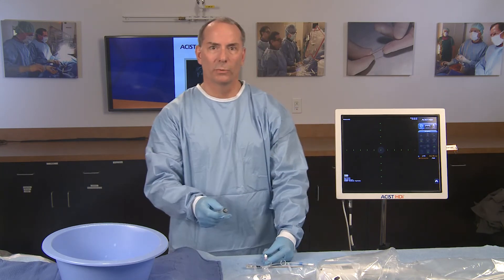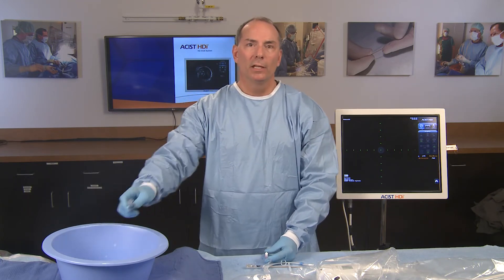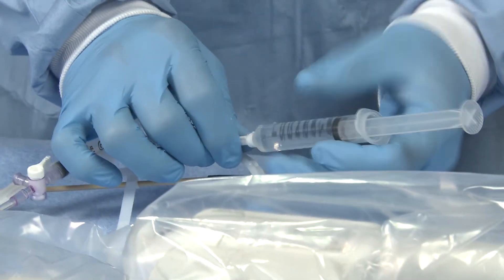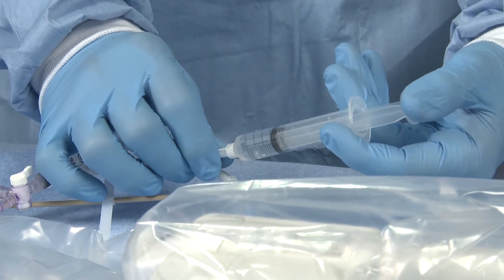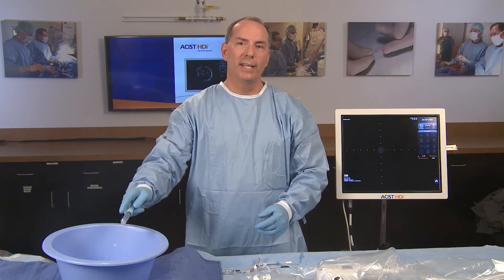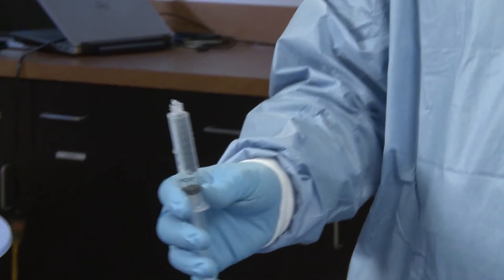The sterile operator starts prepping the Kodama catheter by disconnecting the 10 milliliter syringe and filling it with sterile anticoagulant saline. Clear all the air bubbles and flush the dispenser coil using the coil's luer port. Filling the coil activates the hydrophilic coating. Refill the 10 milliliter syringe with sterile anticoagulant saline, clear all air bubbles, and reconnect the syringe to the catheter stopcock.